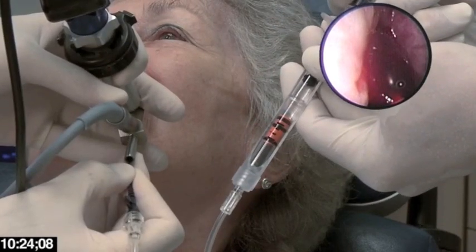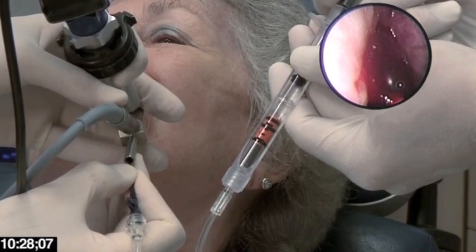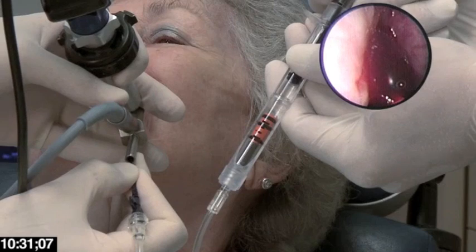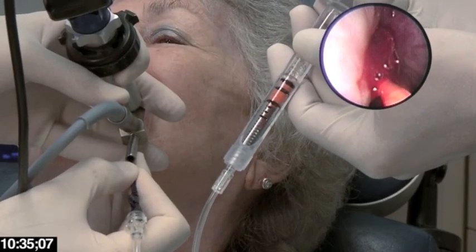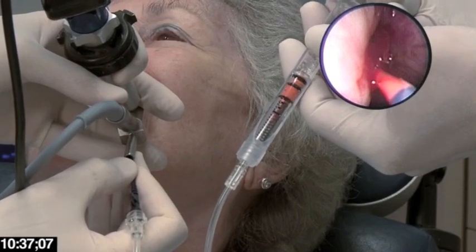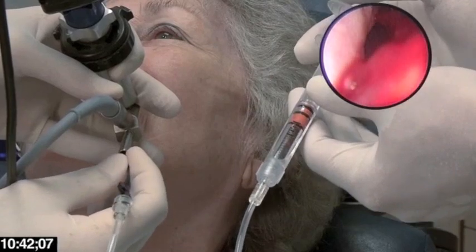I hold the catheter as the inflation is occurring so that the balloon doesn't push itself out of the ostium. Once I know that it's fully deflated and I have no resistance on it, I go ahead and withdraw it from the sinus.